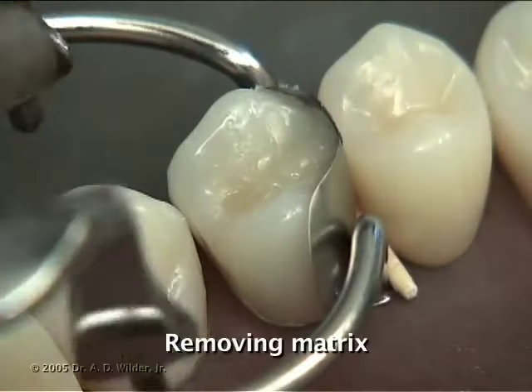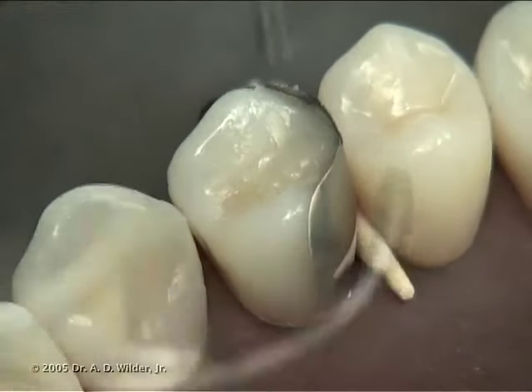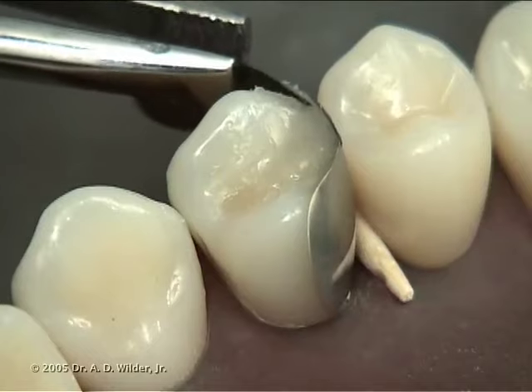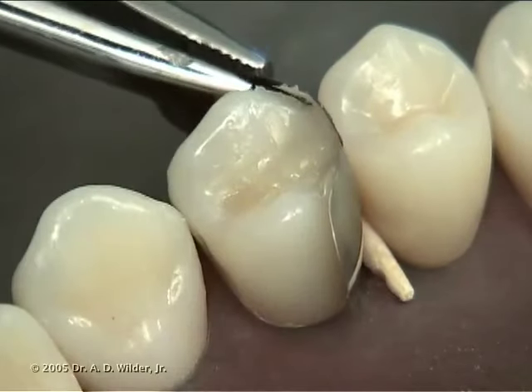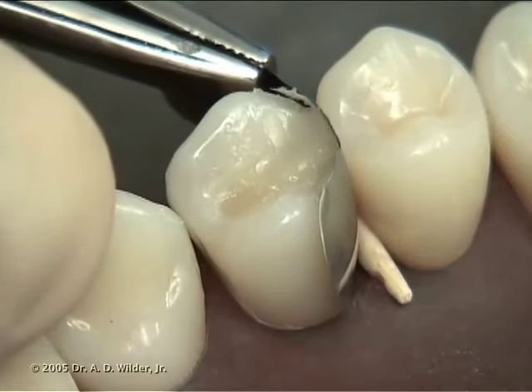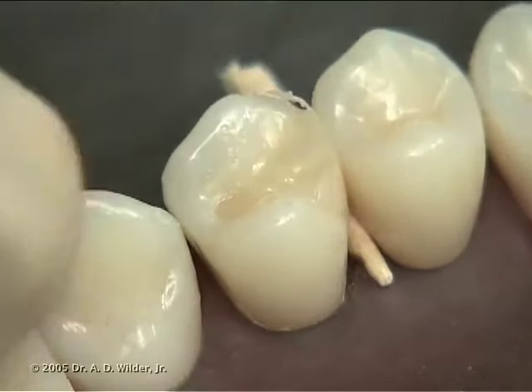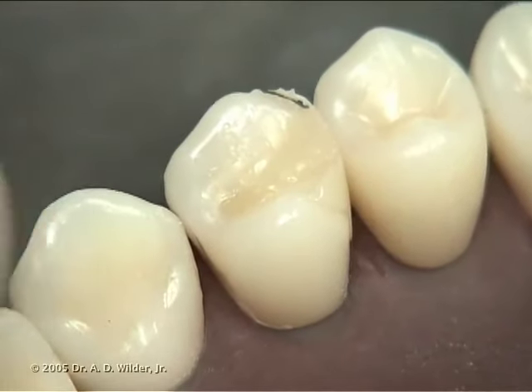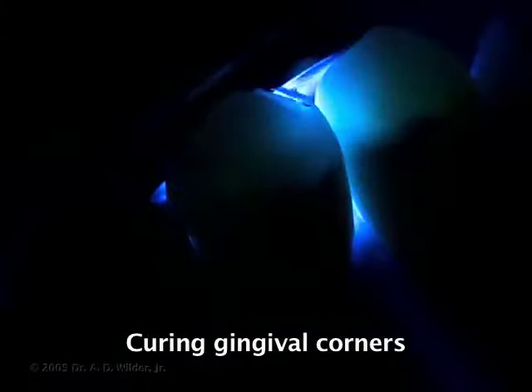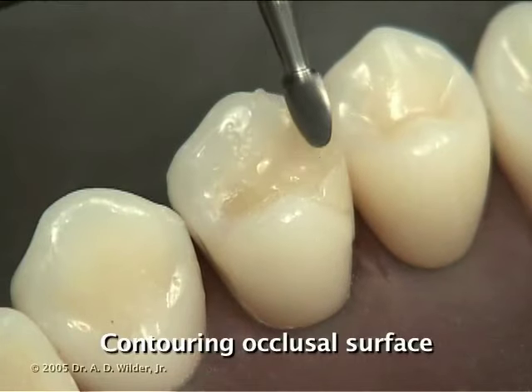Now it's time to remove our matrix system. We take the ring off first, then the matrix band, and finally the wedge. Cure again, this time from the buccal and lingual aspects to ensure polymerization at the gingival margin.